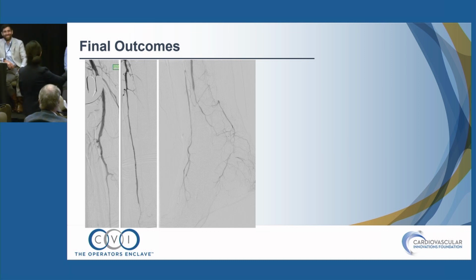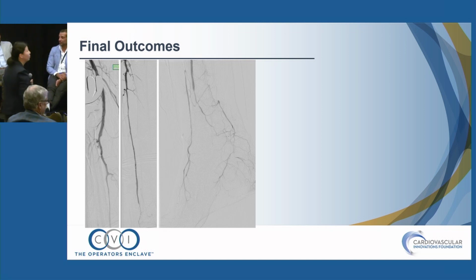I was sheathless in both tibials, so I didn't have a sheath to put a balloon through. But that would be another idea to divert that angle. I mean, the other thing: sheathless for all of my interventions, people, even for balloon angioplasty, I'll do it without a sheath, just bareback. Could you just mention a second, how do you handle, you've made the point several times about how you handle your puncture site?